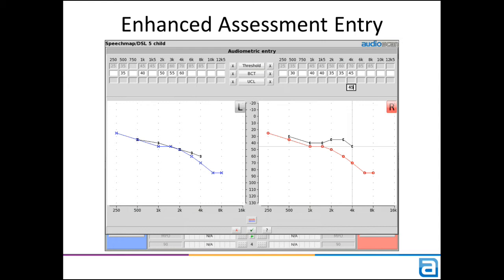The same goes for measured UCL, and once again, if you enter only one side and the opposite ear remains empty, you'll have the option to copy the data. If you need to erase any of these curves, select the small X button beside the data type.